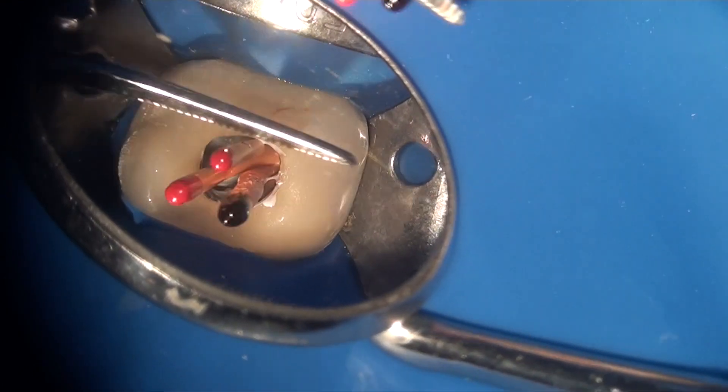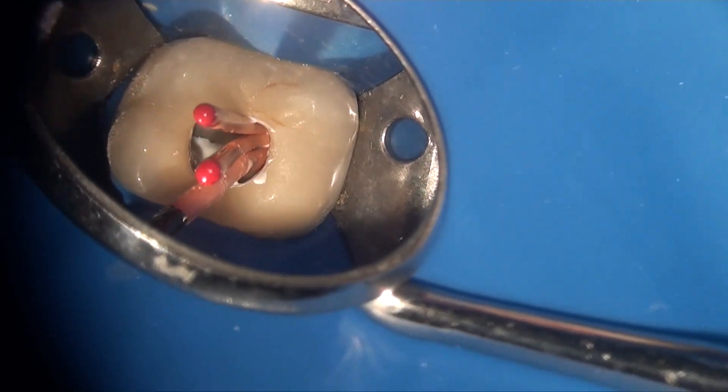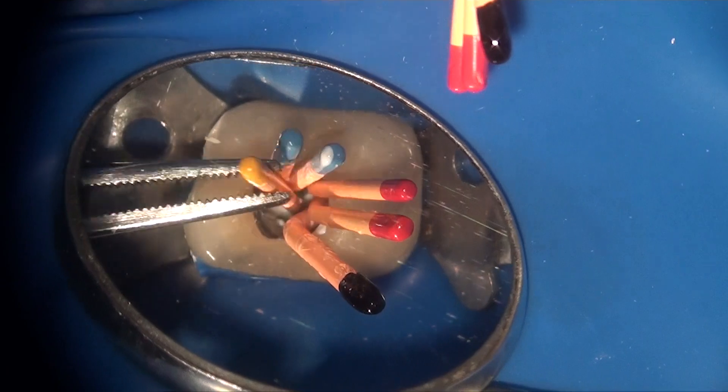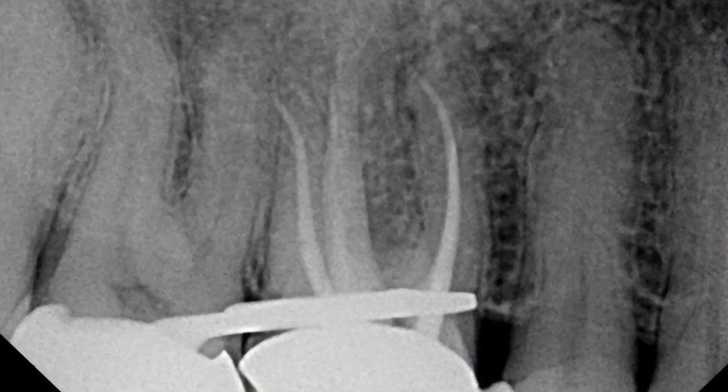Additional cones were also placed in the palatal canal to address the oval area of this canal. A trial fill radiograph shows the appearance of a wide ribbon-shaped palatal root. This root was instrumented with brushing action in the mesiodistal direction to maximize contact with all walls and clean them thoroughly. Hydraulic condensation was performed as described in other videos, and the access was then filled with a provisional.